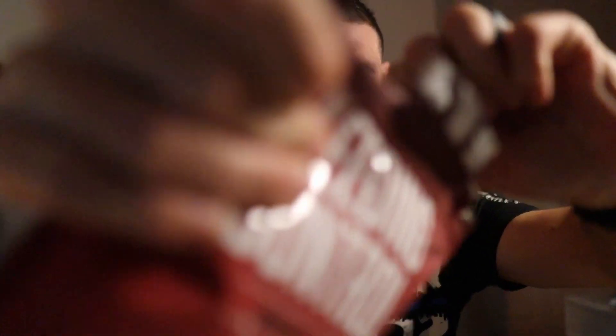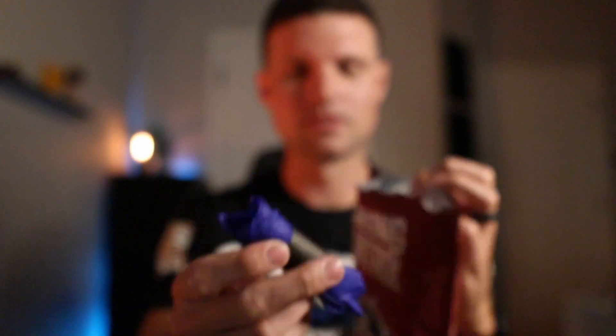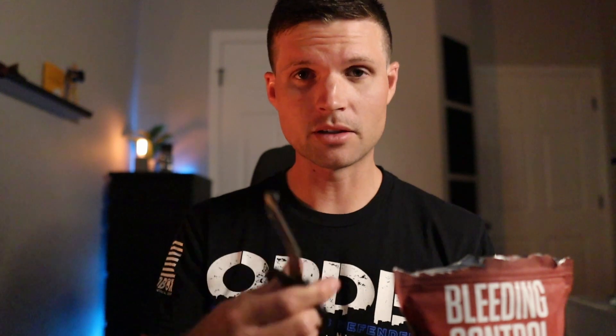As soon as you open the bag, you've got your gloves, tourniquet, and a plastic wrap — I'll talk about that in a second. You've got your shears. You want to make sure that you cut the clothing away when this happens, because we want to make sure there are no other puncture wounds or any other wounds that we need to address. And we want to make sure all obstacles are out of the way of tightening down that tourniquet.